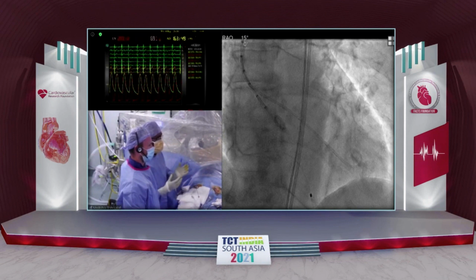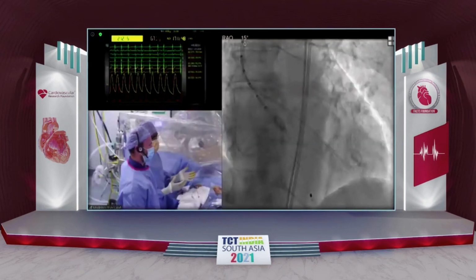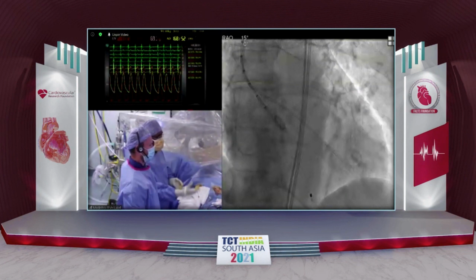If it's a very small anatomy with significant calcification where I'm concerned about expansion, I may go for a supra-annular technology. If a patient already has pre-existing coronary artery disease and I'm thinking of reaccessing, then I'll choose a valve that has easier options for reaccessing coronary anatomy, like this one or a Sapien.